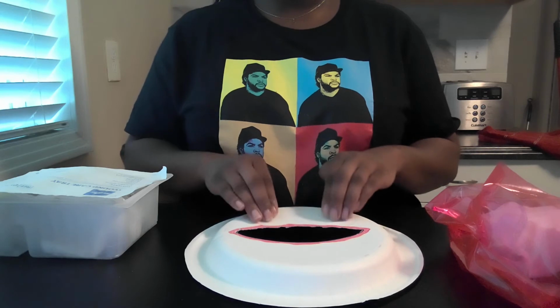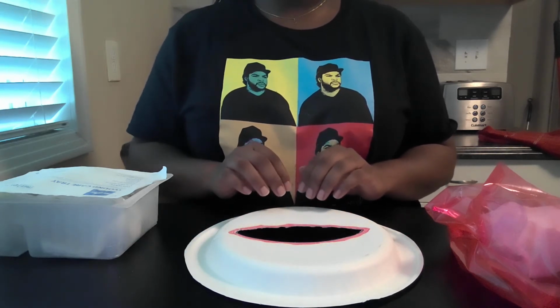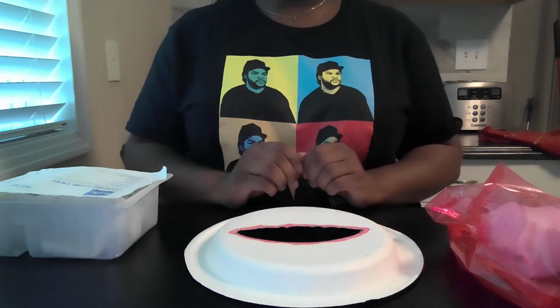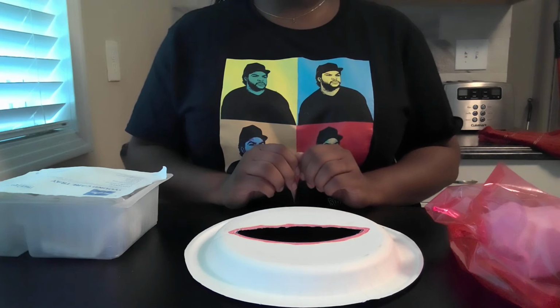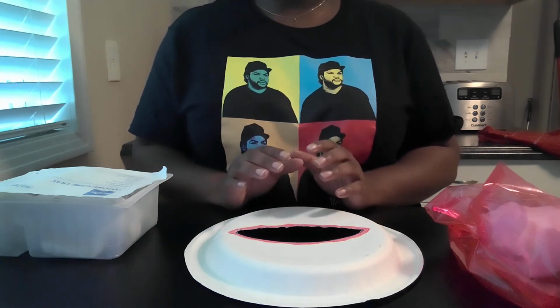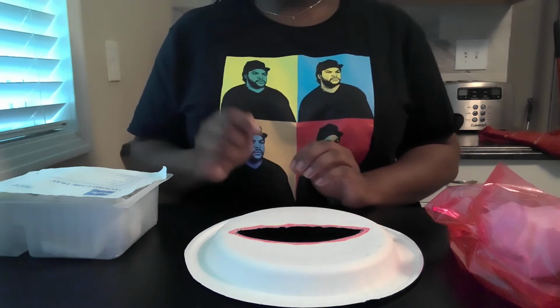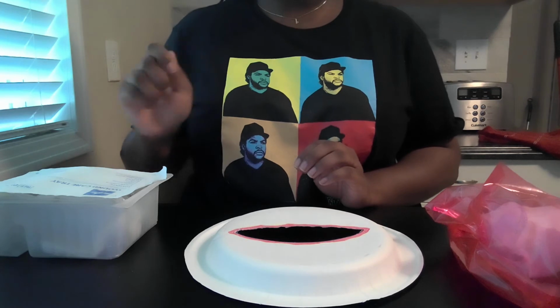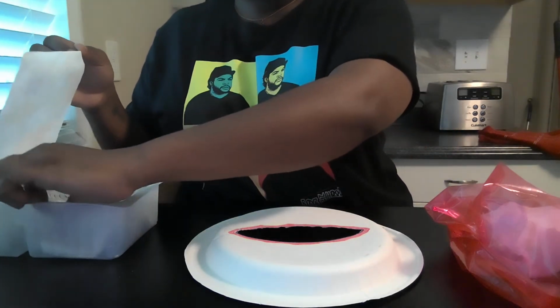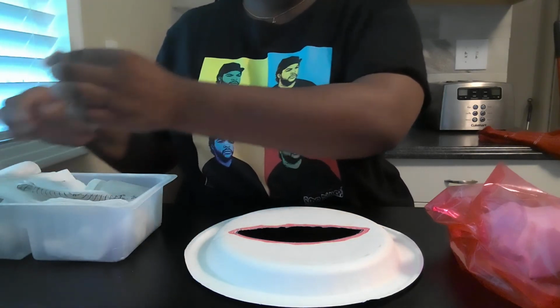And while I do that, I also want to check for any loss of skin integrity around the wound as well. And now that I've done that, I'm going to reassess the patient for pain. And when I do that, I just want to grab a cotton swab, a little cotton swab tip applicator, and that's going to be within this packaging here.